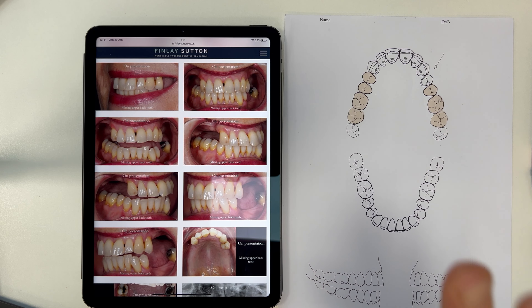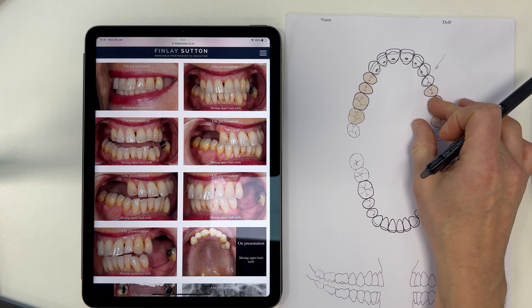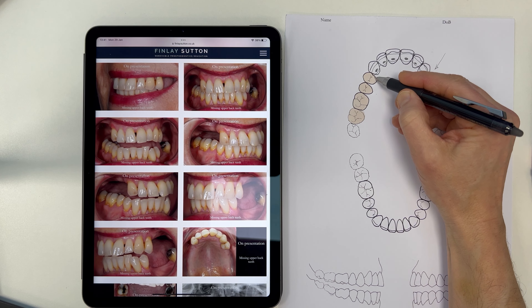In the lower we don't have the tongue to rest the denture on, whereas here we've got all of this lovely palate. Now in terms of the hygienic Scandinavian design, I want to keep as much of the metal componentry away from the gingival margin.